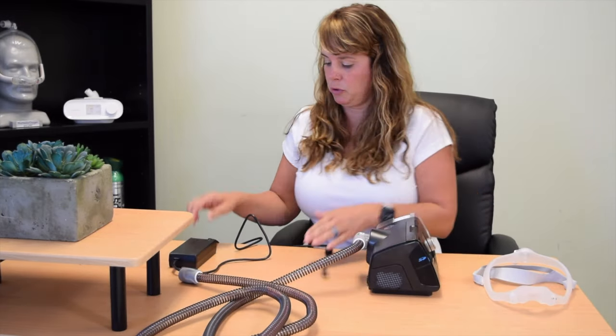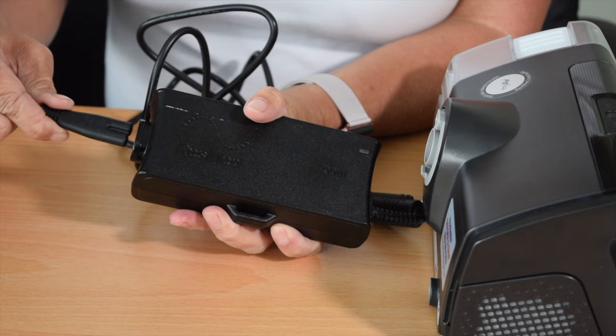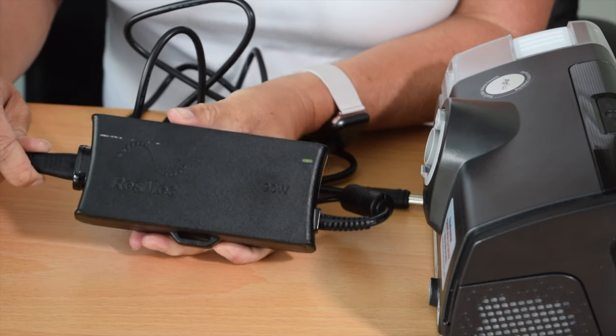The first one we're going to talk about is the plug or the power source. On the plug, there are actually two parts to it. So when it comes in the bag, it comes with these guys disconnected. A lot of times when the patient puts that plug in, it doesn't get connected all the way, so it's kind of loose and therefore the machine is not going to get the power.